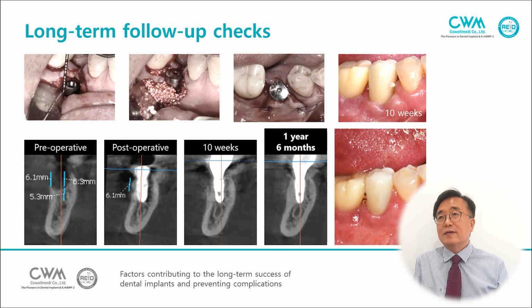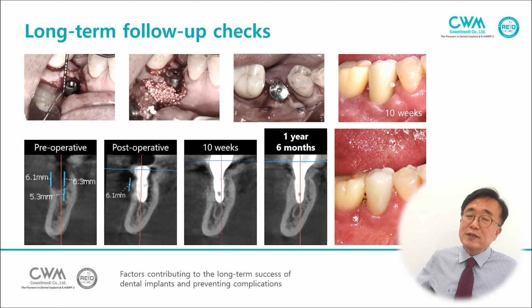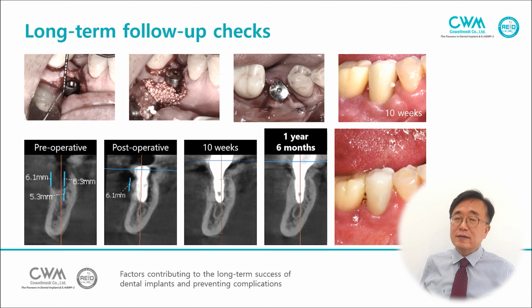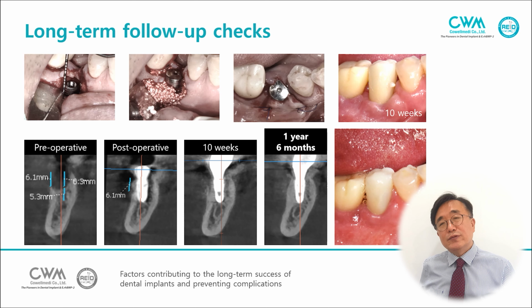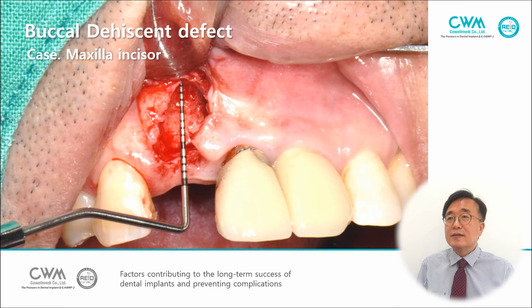And buccal defect of mandibular molar. So the buccal bone graft with the implant. So healing abutment connected. After 10 weeks, restoration was inserted. So after 1 year and 6 months, new cortical bone buccal plate is maintained, and gingival line is also maintained.